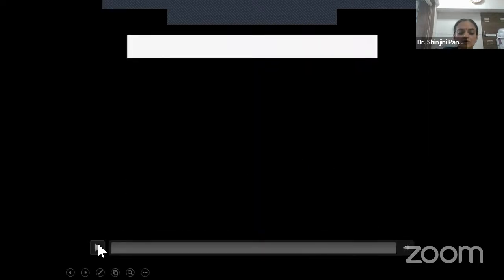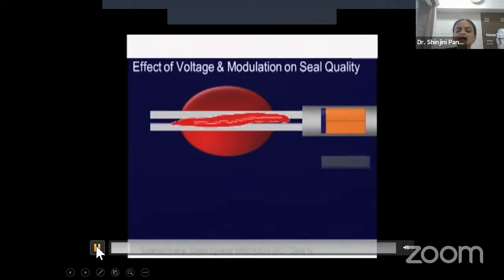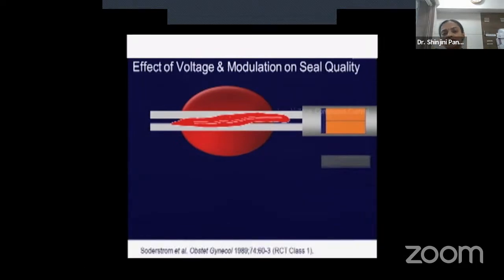Now let's come to this video. Just imagine that you are doing an open surgery, or even a lap surgery for that matter, and you encounter a bleeder. When you encounter a bleeder, the first thing you will do, at least in open surgery, is catch it with your artery forceps and ask your assistant to buzz it with the monopolar pencil. If you see everyday surgery, all of us actually press the blue, because we think we should press blue because of the word coag. So we feel that it will be immediately hemostatic. In actuality, it is totally opposite.